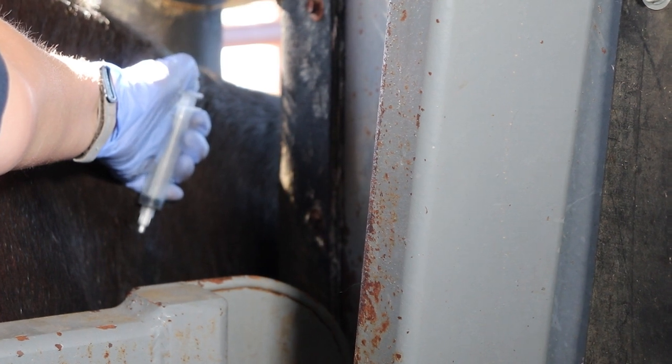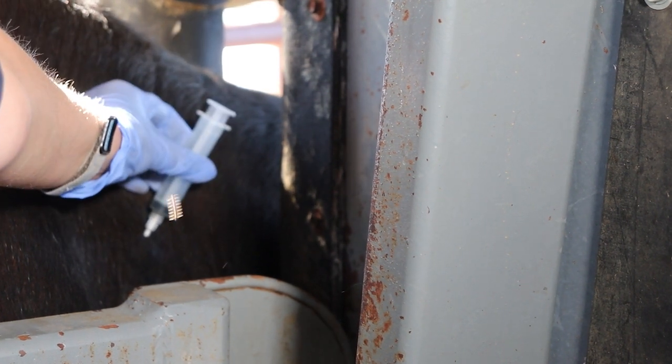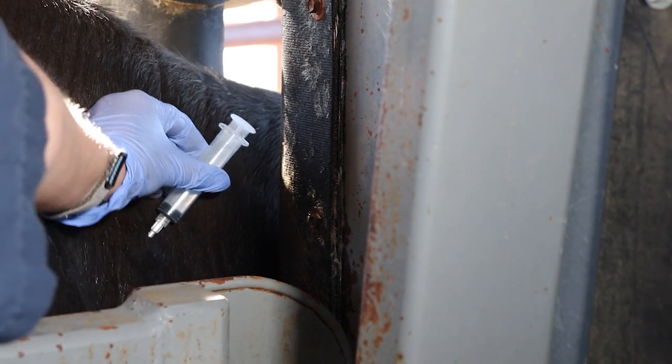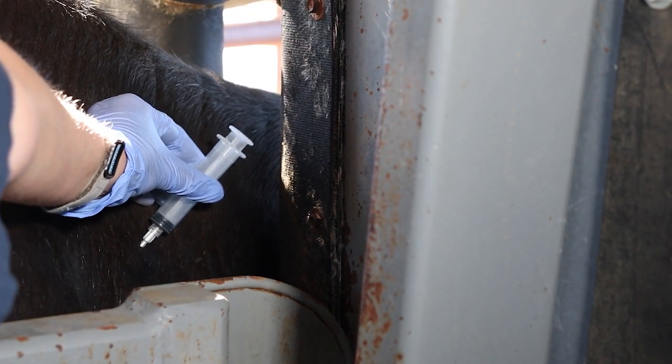Press the plunger to deliver the injection. There should be no resistance. If you encounter resistance, you are probably in the skin — redirect the needle and give the drug once it's easy to do.